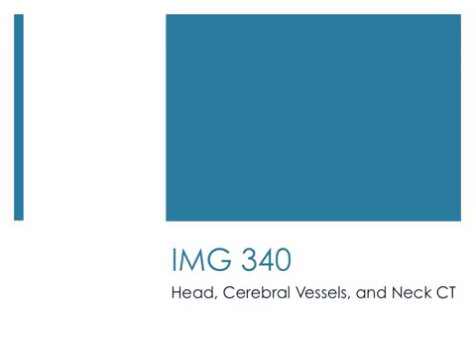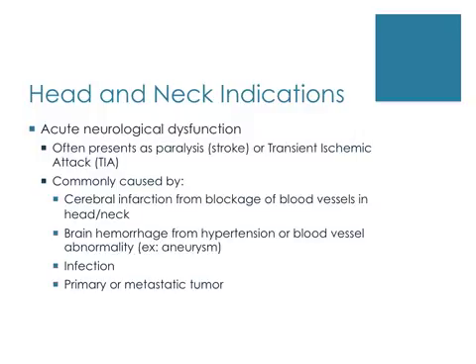IMG 340, head, cerebral vessels, and neck CT. We will begin by discussing some head and neck clinical indications. First is acute neurological dysfunction.